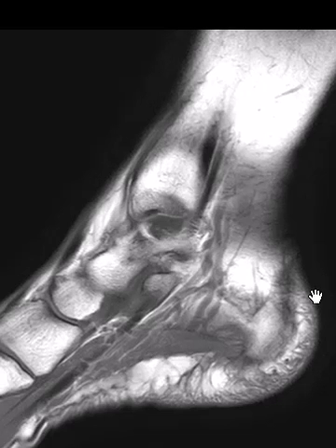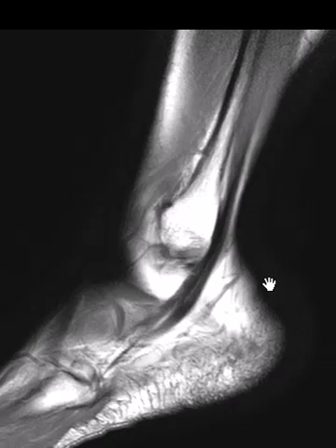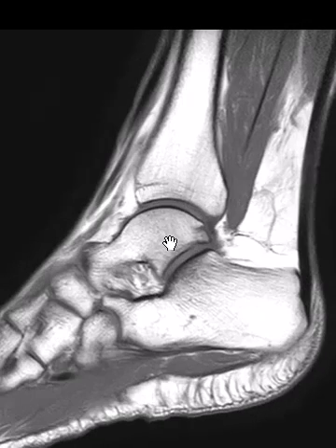Hello, this is Dr. Gay from First Look MRI, and this is a 61-year-old female with pain in the ankle. They thought she had a posterior tibial tendon tear, but that checked out okay. She had a couple little findings, but the main one is in the talar dome.